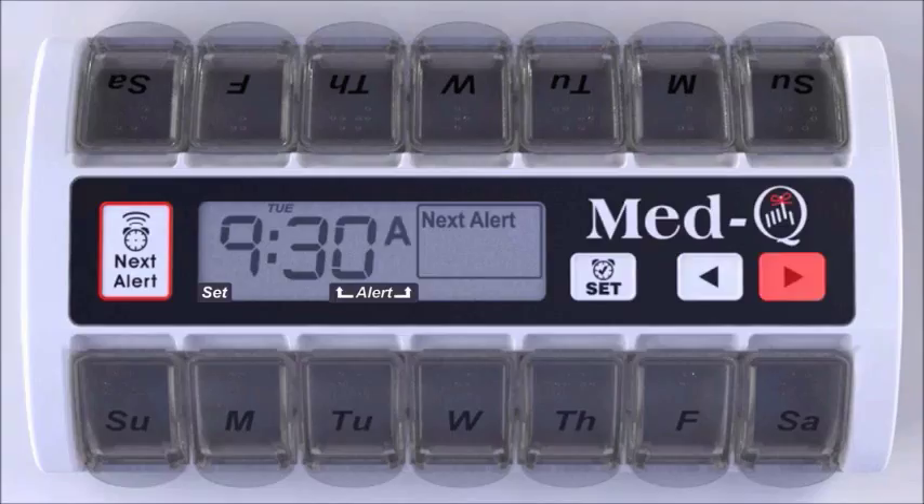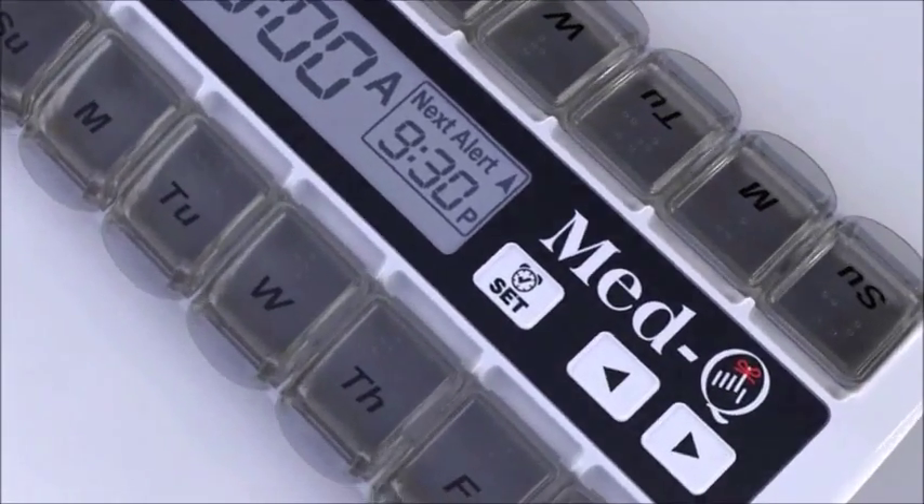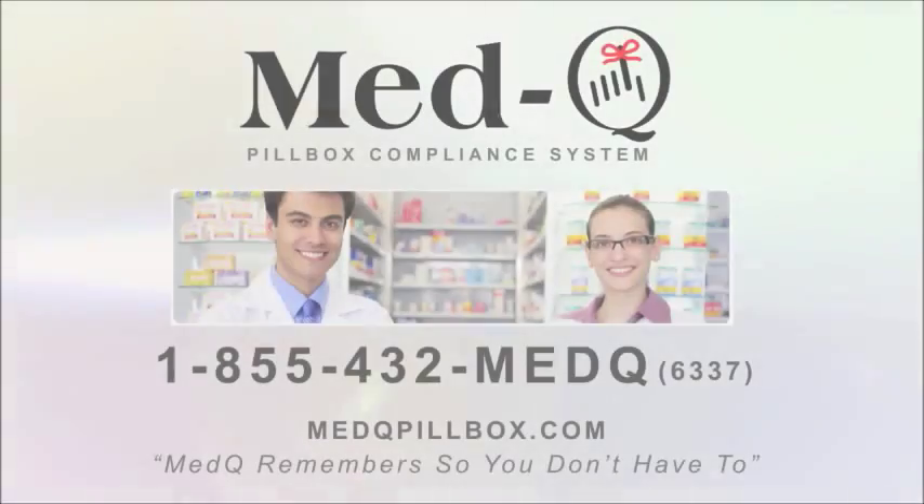Using the arrow key, scroll to A for AM or P for PM and release. Your Med-Q is now set for two daily alerts for your pills and vitamins for one full week. No more worries. No more forgetting. Med-Q remembers, so you don't have to.